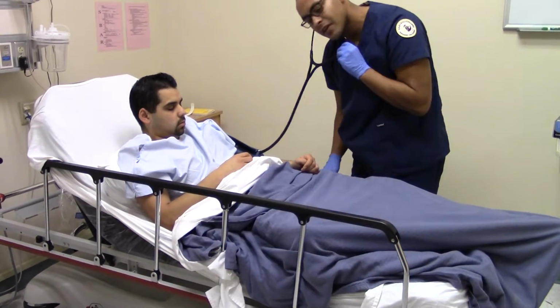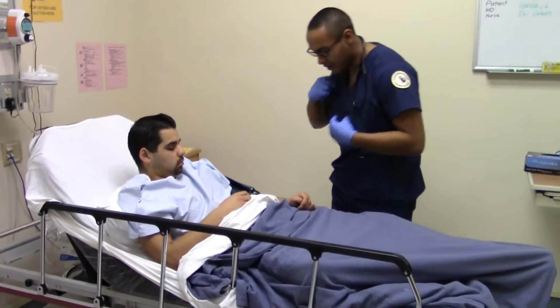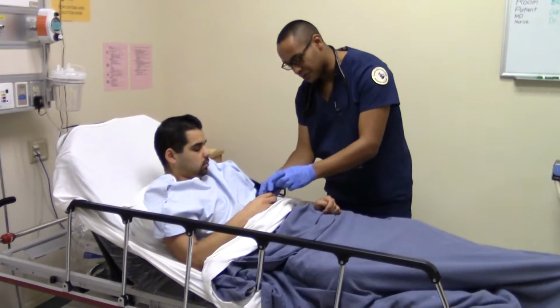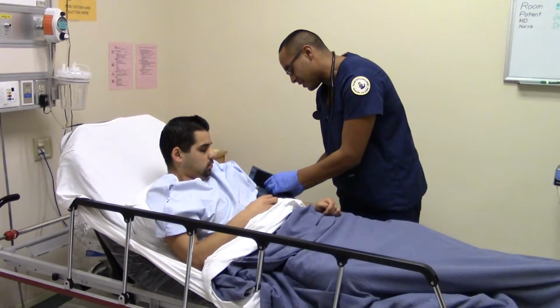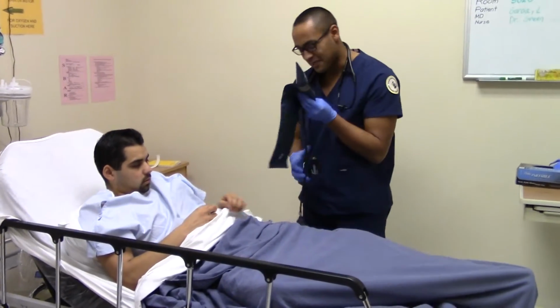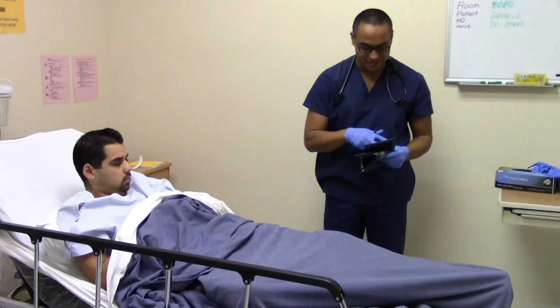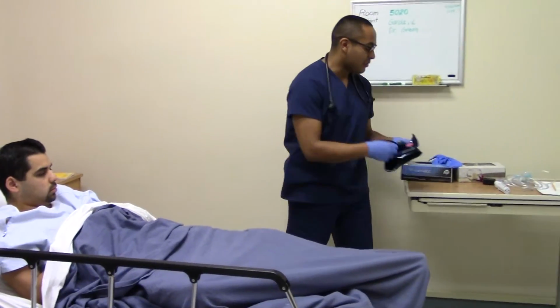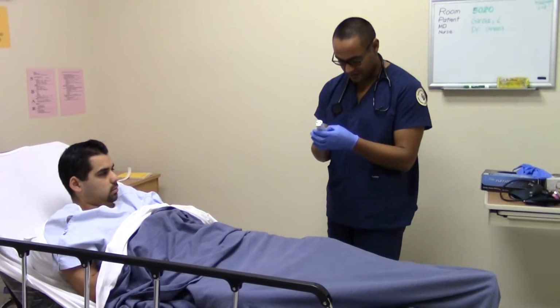Oh, well, that's really good. All right, 120 over 80. It was pretty similar. That's textbook. That's total baseline. All right, that's good. I'm going to check your forced breathing.